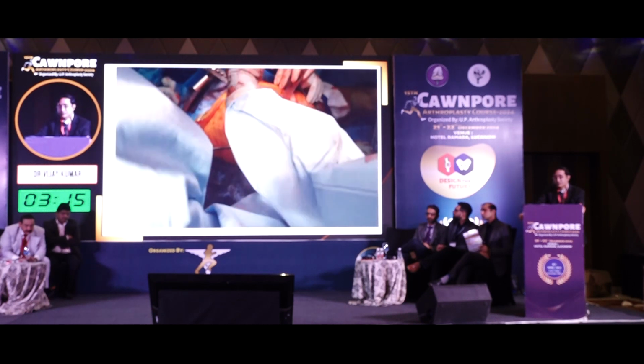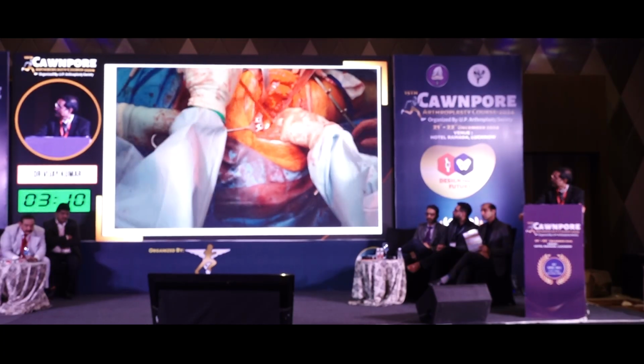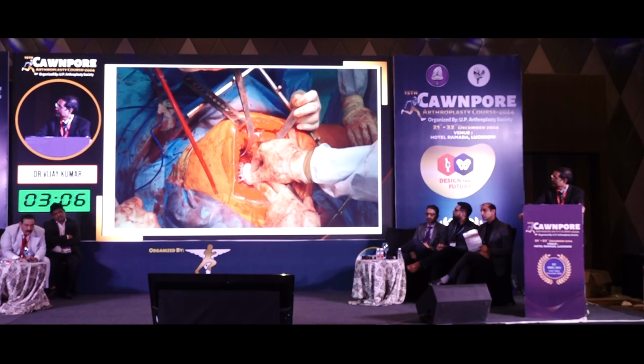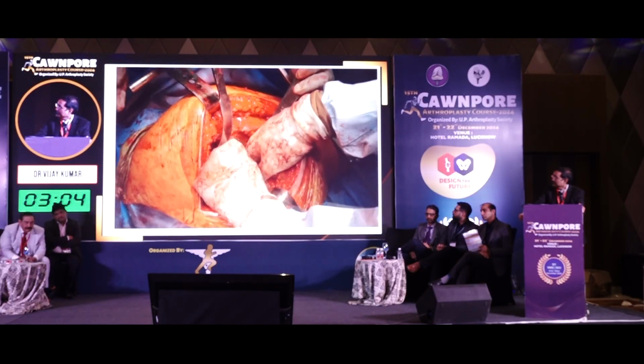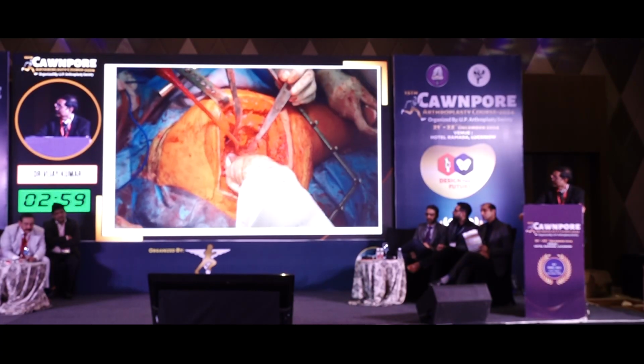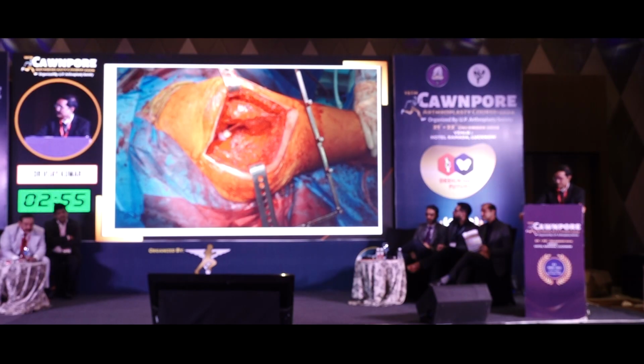Once you have the screw, then you again assess the position of the cage. Once that has been put, then you put screws in the flange. There you can bend the flanges also, and this is the liner. This is a cementless liner. It has snapped inside, and it's got around 20-degree posterior elevation and around 4 or 5-degree elevation all around, and this is the final surgery which is done.